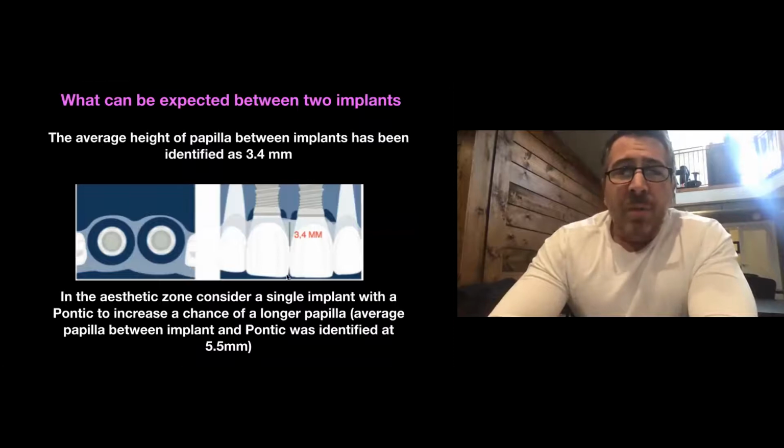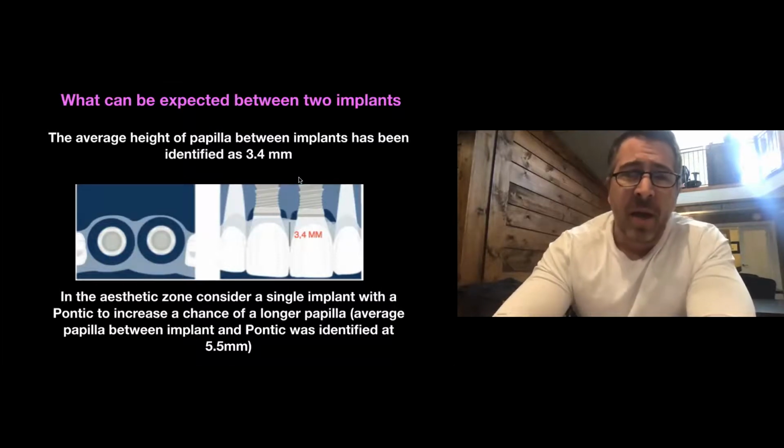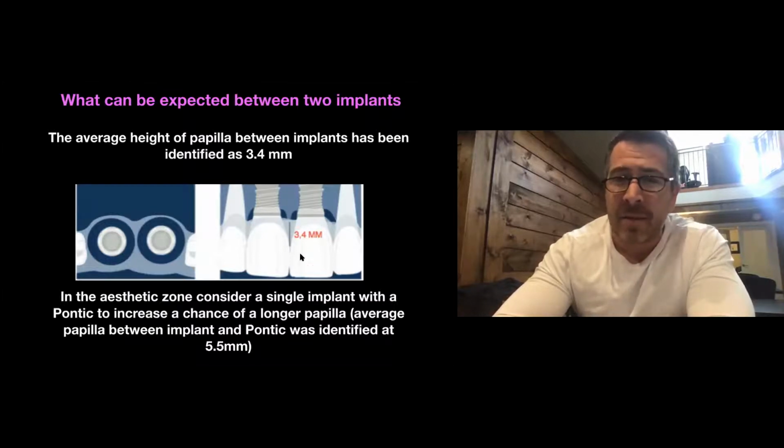So with multiple missing teeth, we have to make a decision about where we're actually going to place our implants. And so now we need to understand some parameters about placing implants adjacent to each other. So when we place implants adjacent to each other, by default, we're going to end up with a smaller papilla. That's just the way it is. So between two implants, you're not going to get 4.5 to 5 millimeter papillas. You're going to get 3 to 4 millimeter papillas. So you've got to be a little careful placing implants next to each other in the aesthetic zone.